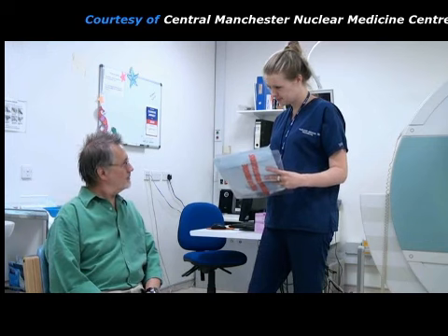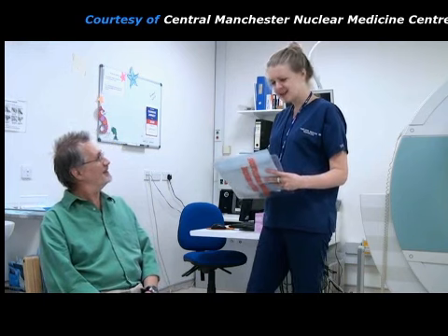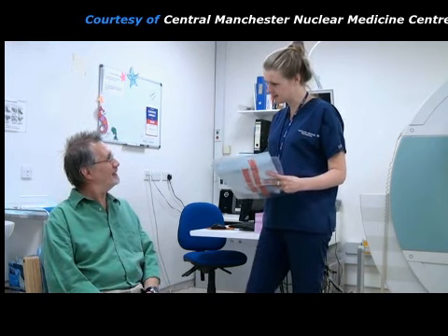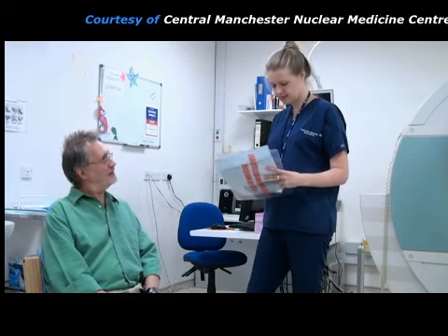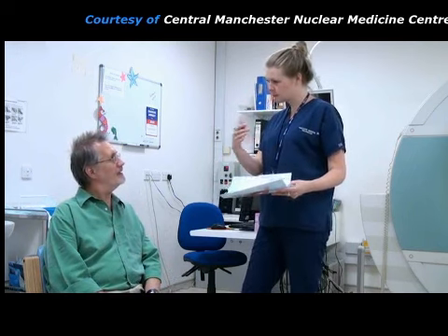The practitioner checks the patient's identification to make sure that she has the correct person. She asks the patient about his symptoms. Then she explains what will happen during the test and answers any questions that the patient may have about it.